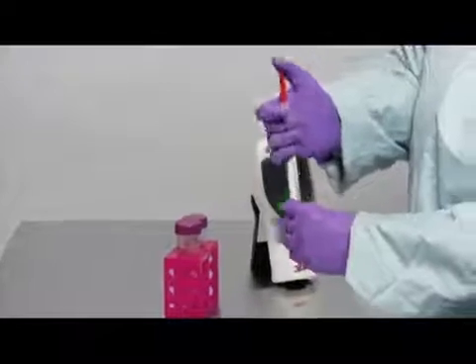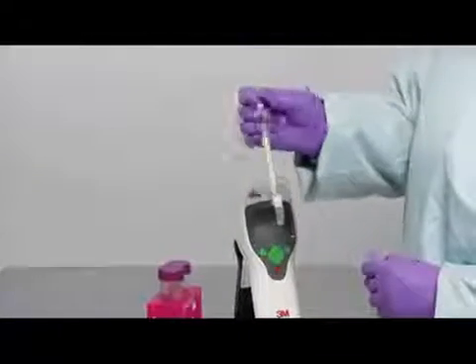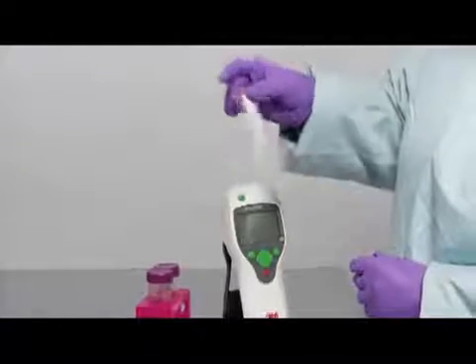You actuate, shake back and forth for a good 5 seconds, and then read in the luminometer.